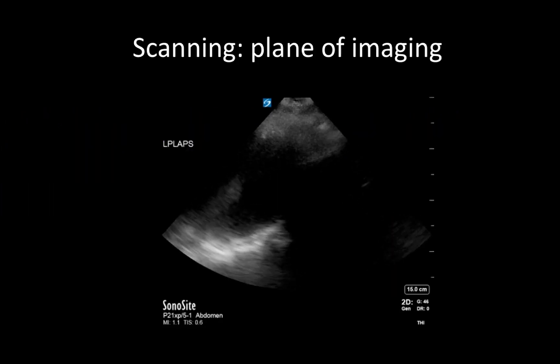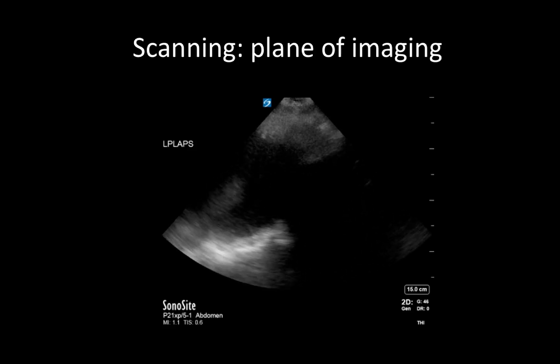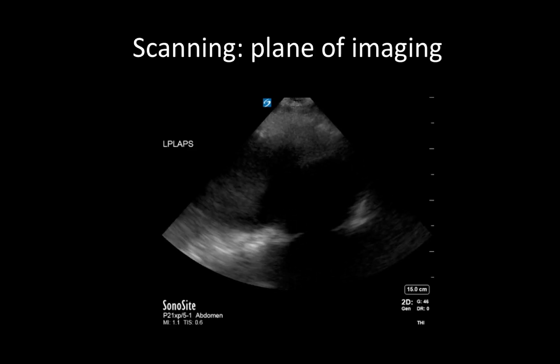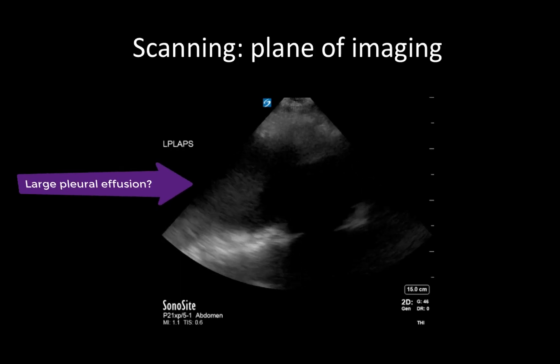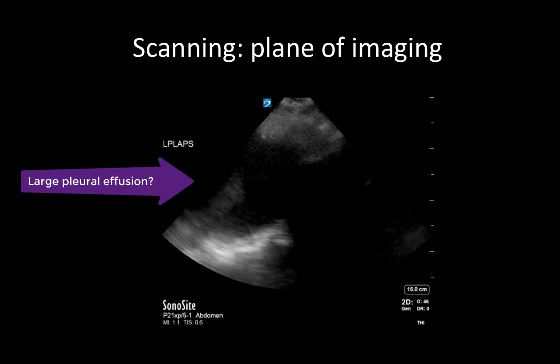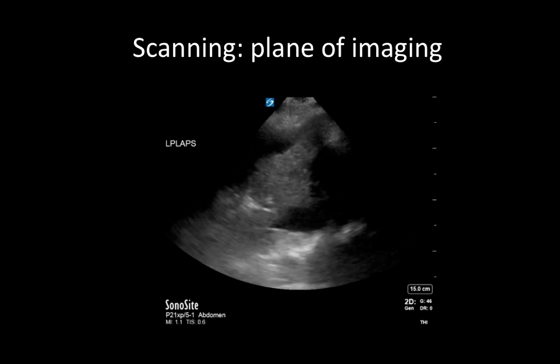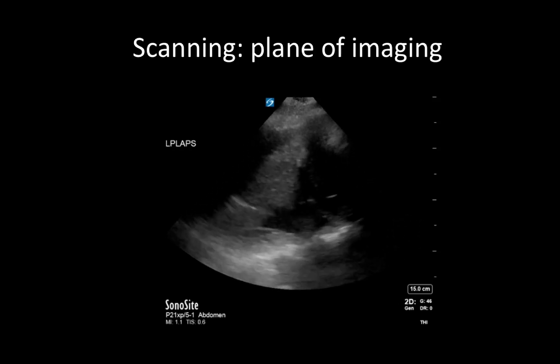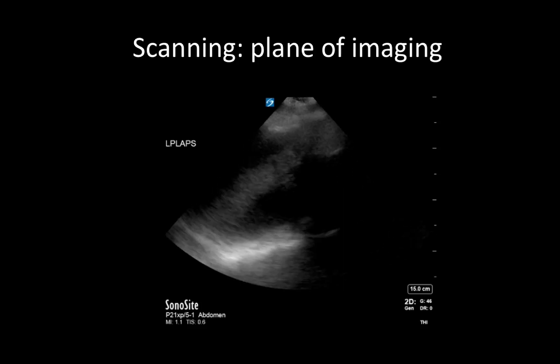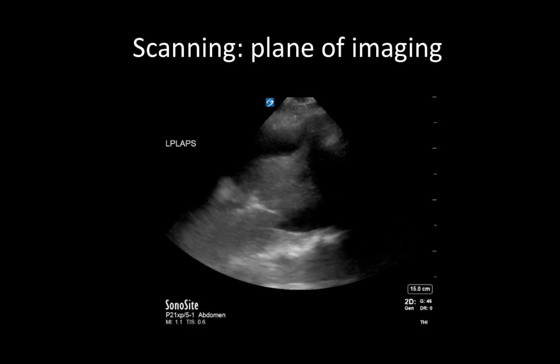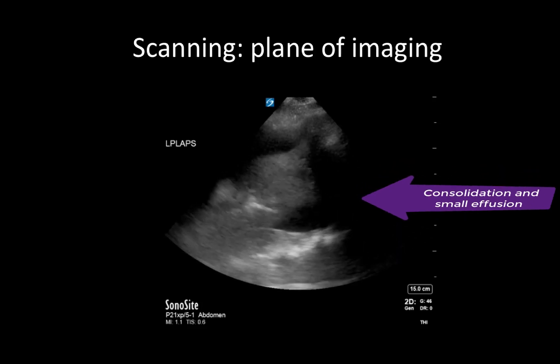In the most dependent views, being out of plane can commonly result in the misinterpretation of a pleural effusion. For example, we see a great deal of anechoic space which might be falsely interpreted as a large pleural effusion. However, by correcting our view and sliding the probe more posteriorly to be truly perpendicular to the pleura, we can see that this actually represents a large amount of consolidated lung with a small associated pleural effusion.